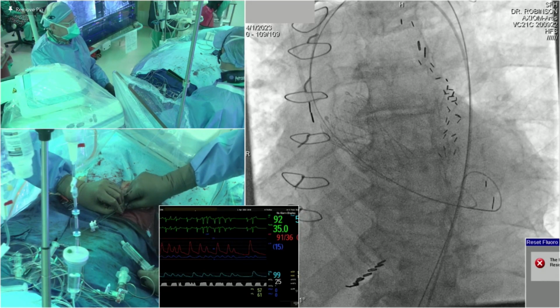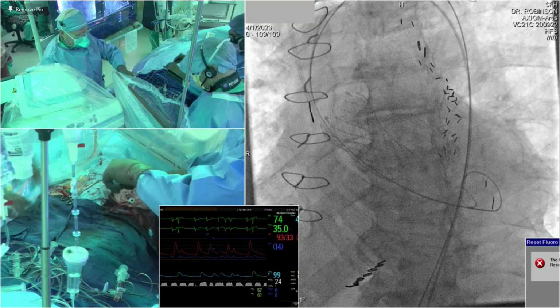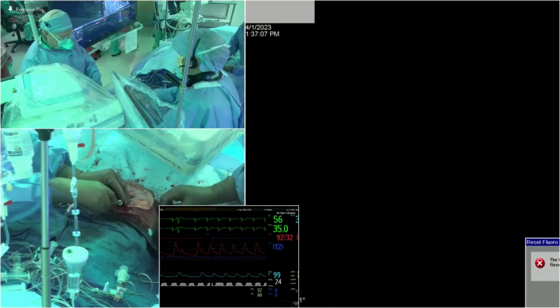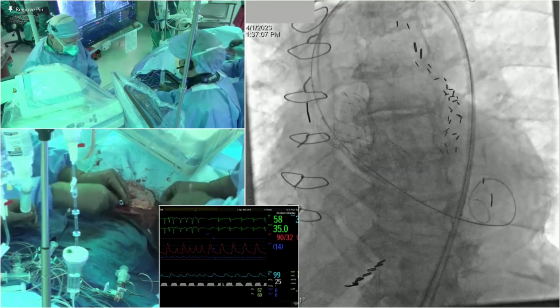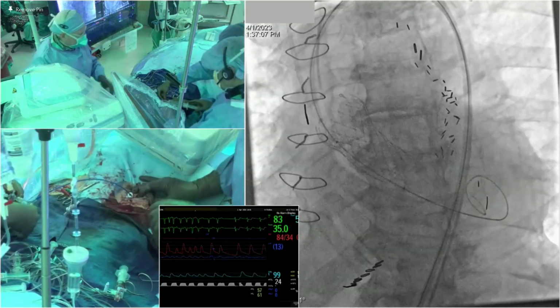So what we just did there was we took the valve out, we put a sheath in because the Evolut has an inline sheath. It doesn't go through its own sheath. It goes in on its own. So we put our 14 French sheath back, bang up with the balloon. Okay. Want to pace at 180? 1 second. Clip this back on here.